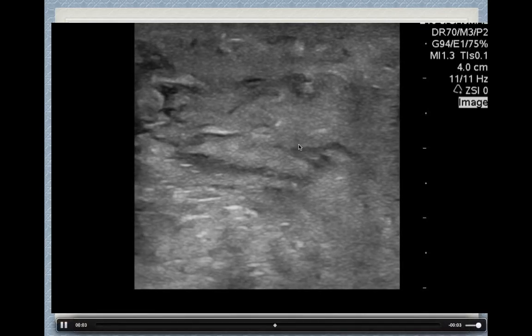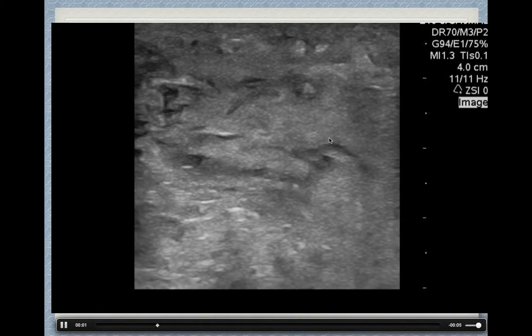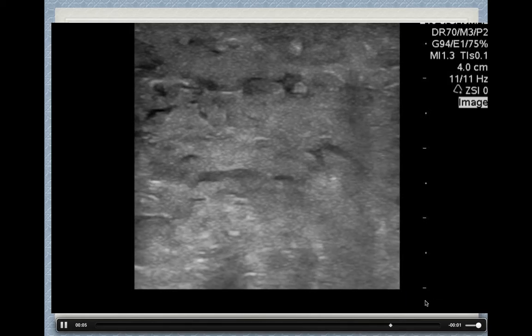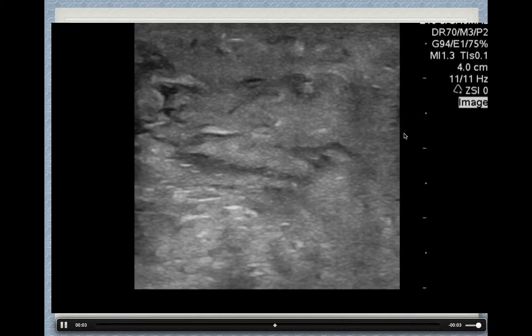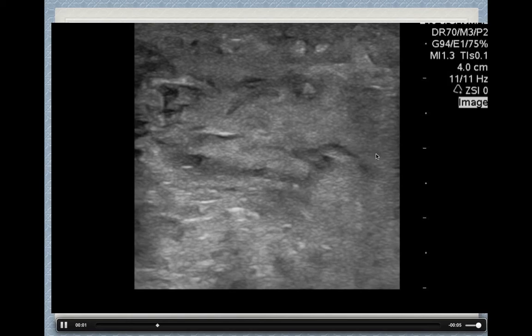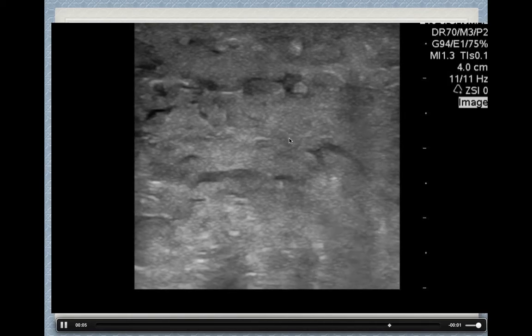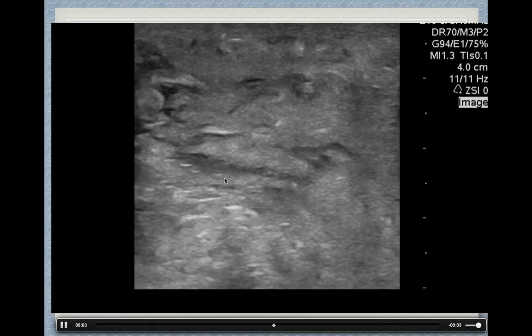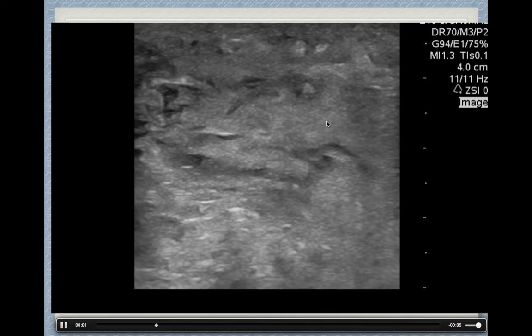Again, at first glance, it doesn't look like much, but as you move the probe, you can see this movement of material. So this is an abscess pretty deep here. Again, it doesn't have the calipers on the right here. It's probably somewhere around 4 to 5 centimeters, so this is about 2 centimeters down. Here is where you'll see some movement of fluid, so you probably could get some satisfying drainage from incising this wound as well. And as you can see, it's very bright down here, suggesting there might be some fluid medium passing through.